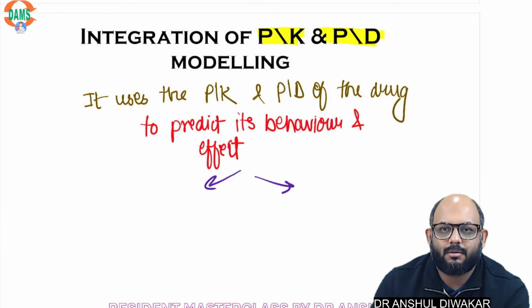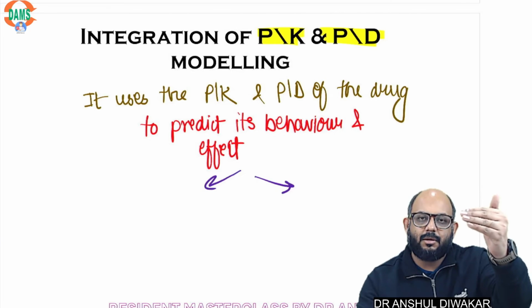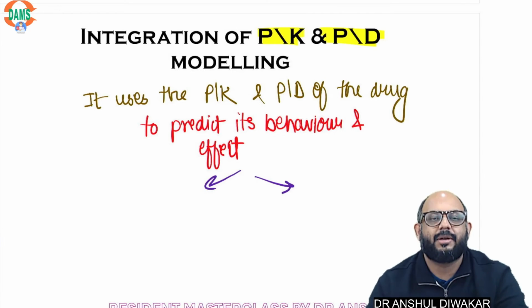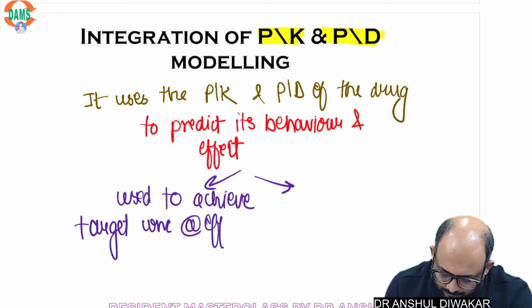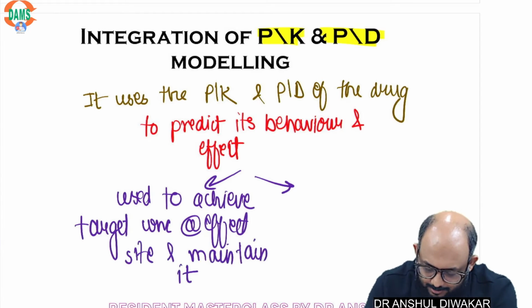This integration achieves two things. It is used to achieve the desired target concentration at the effect site and to maintain it. What is important is to maintain it, and it provides real-time adjustment.